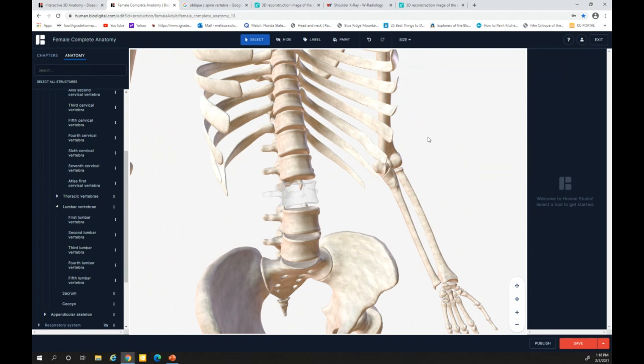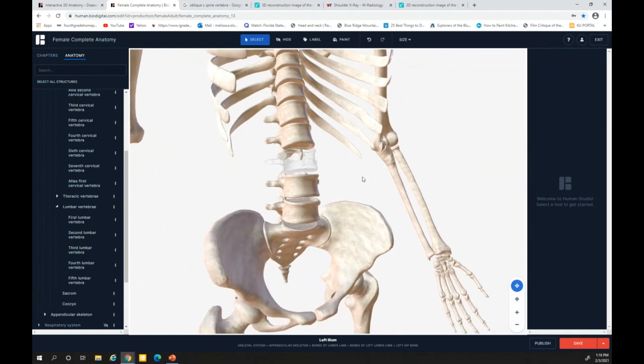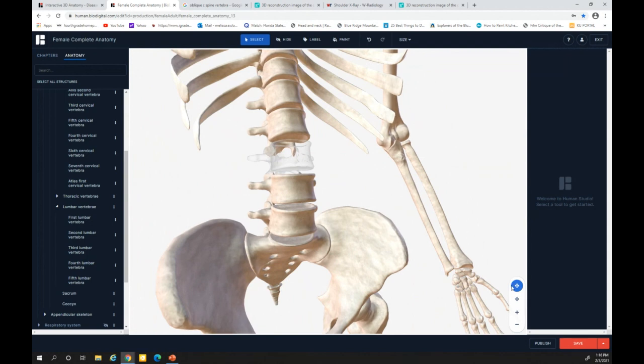Now we're looking at our patient's front. Their back is on the bucky, which is that white screen behind him. I'm going to try to move him a little bit. You can still see the ilium there. No. Let me try this.